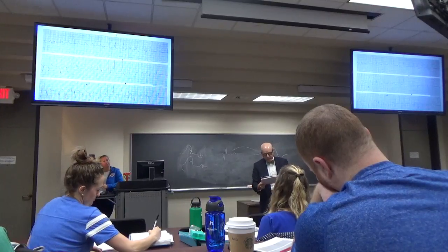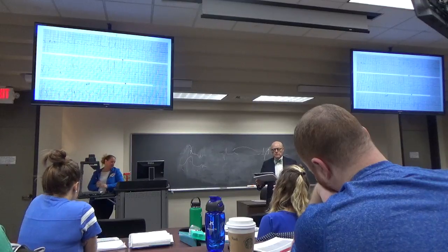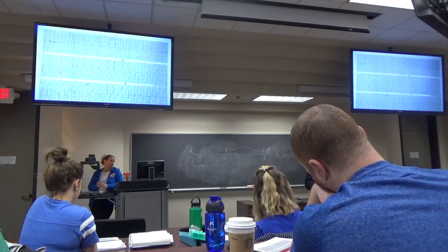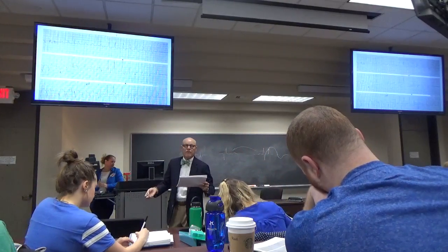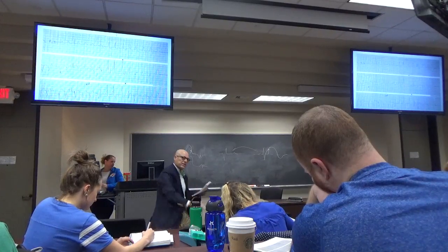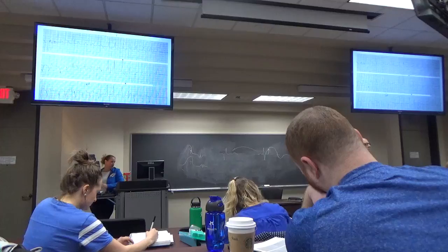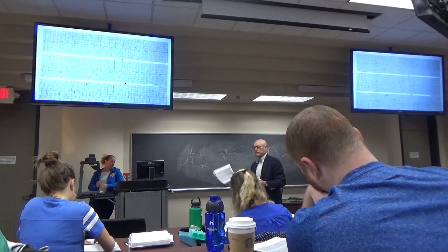I look at this EKG, and there's nothing about this EKG that looks like left ventricular hypertrophy. There's no big R wave in V5, right? Remember we count the R wave in V5 and add it to the S wave in V2? There's neither one. There's not an R wave in V5. There's not an S wave in V2. Can't count them up. You probably can't make the diagnosis of LVH on this EKG.